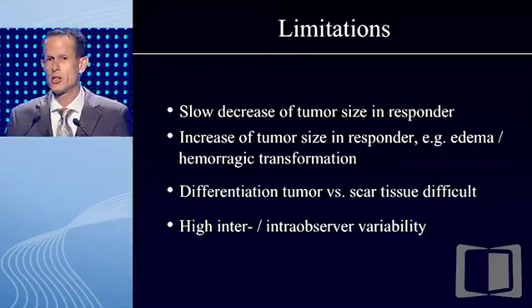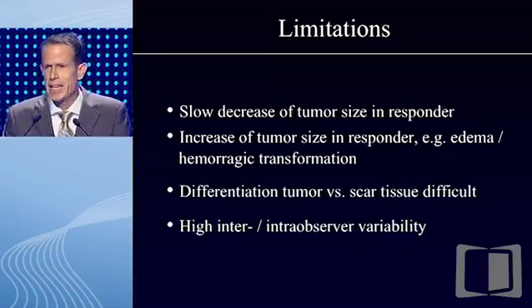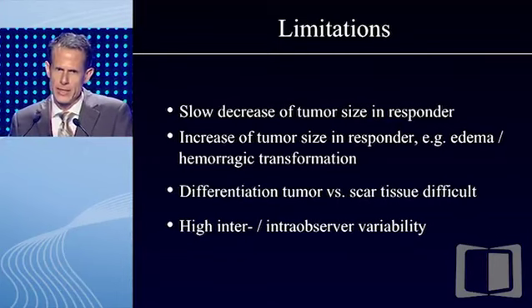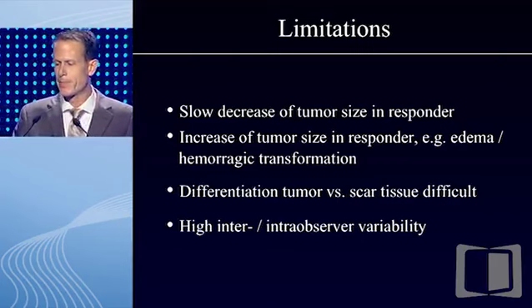There are limitations when we talk about size and morphology. Even if we have responders to some form of therapy, there might be a very slow decrease in tumor size, so we don't capture the decrease of tumor size.